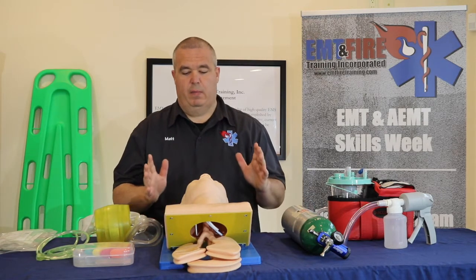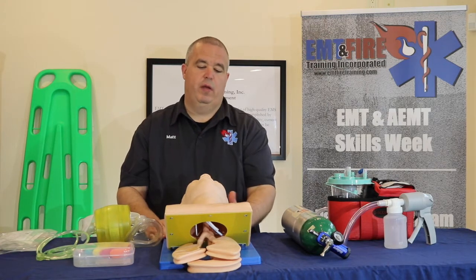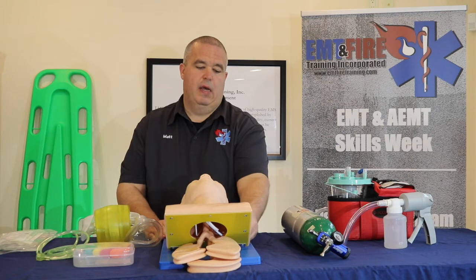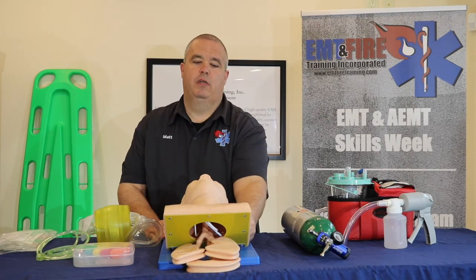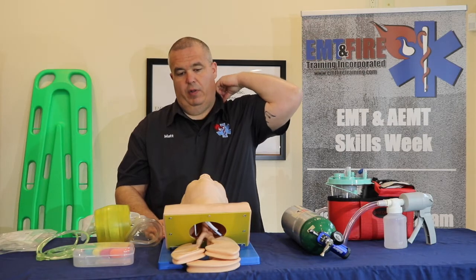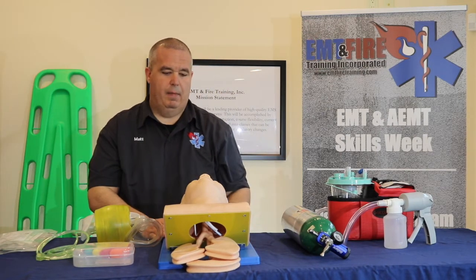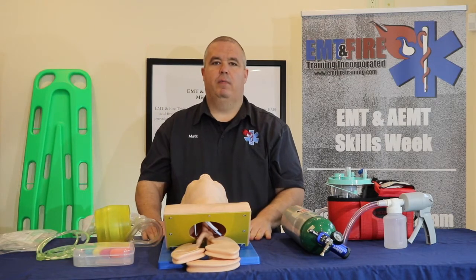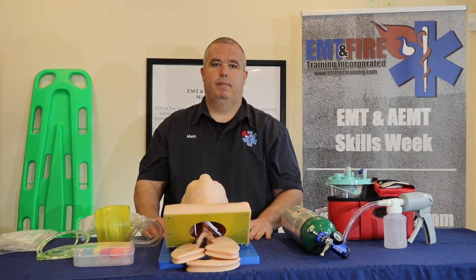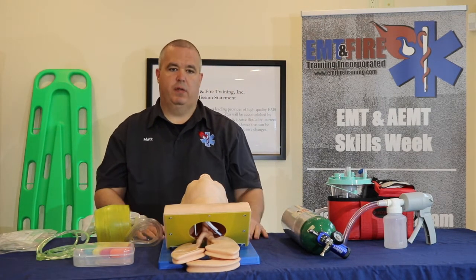We come up and shake and shout: 'Sir, can you hear me?' No response. Then we go on to a painful stimulus. I like to use the trap pinch — pinching their trap really hard. Some people still do the sternum rub; that's falling out of favor, but it's still very effective. We need to try to elicit some kind of painful stimulus to see if he'll respond.